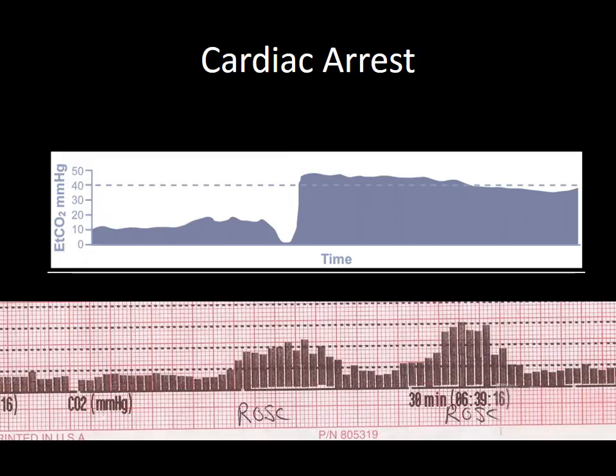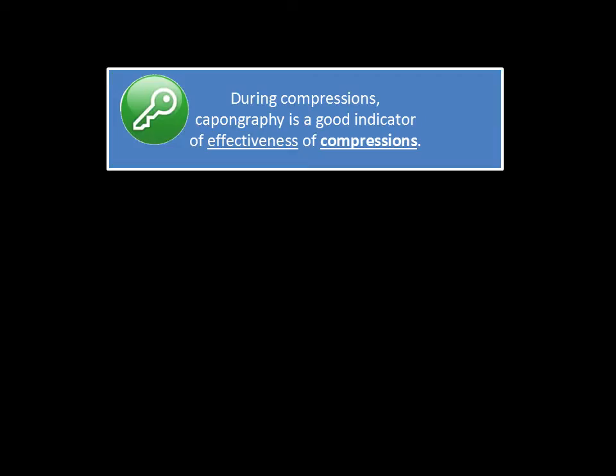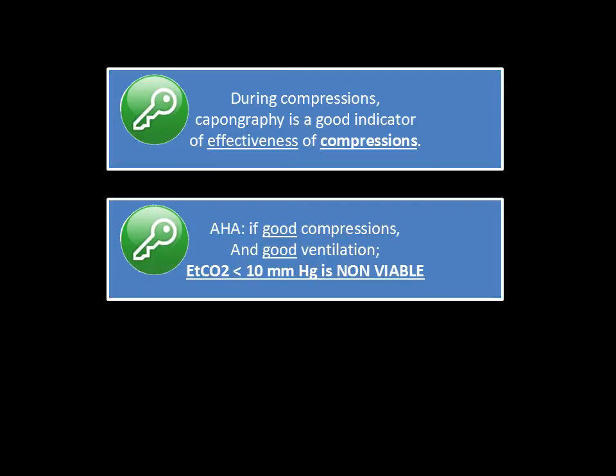Also, cardiac arrest, not only measuring your great CPR, but also you see a spike in CO2 when you're doing compressions. That means that your patient had a return of spontaneous circulation. Remember, during compressions, capnography is a good indicator of effectiveness of compressions.